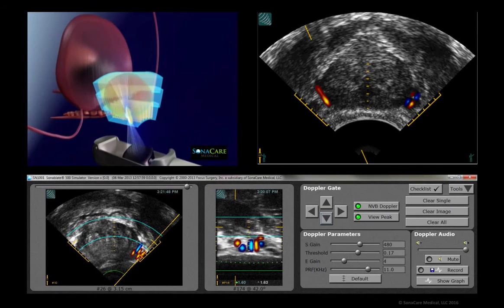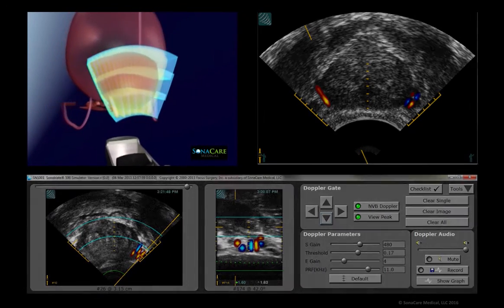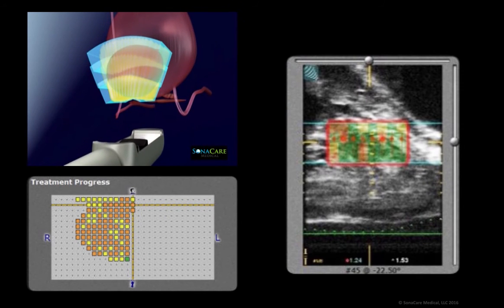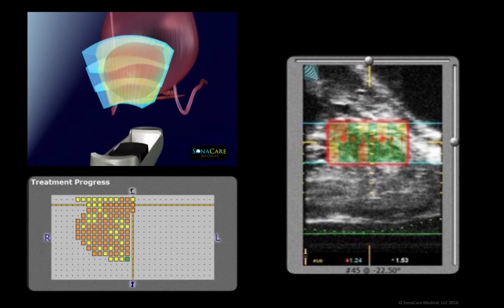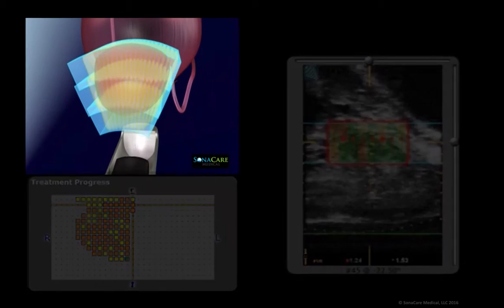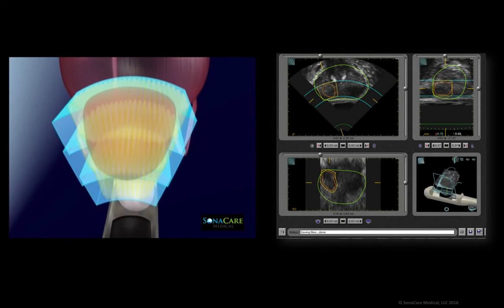Sonoblate's technology also features TCM, or tissue change monitoring, which gives the physician immediate visual feedback about the level of tissue transformation within the targeted zone.